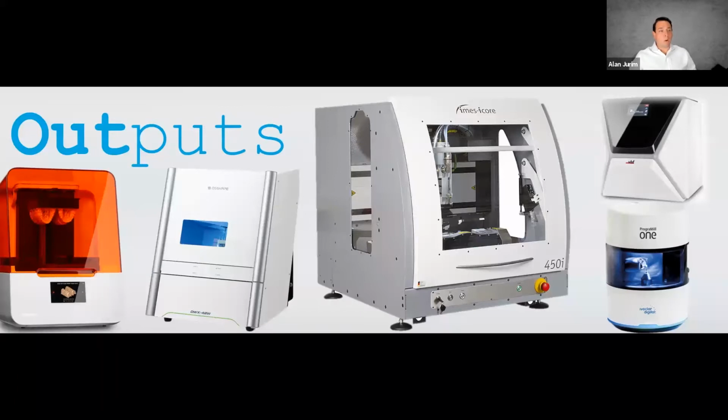So when we talk about outputs, what we're really discussing is how we take the information that we've now generated on a computer screen and actually produce it in real time. And that traditionally was done through milling systems. In fact, here we have 4 different milling systems on the screen. And as time has come on with 3D printing and dentistry, printing is really beginning to surpass and overtake milling in some areas because of the predictability, the ease of printing, and the flexibility that we just can't always achieve with just milling.